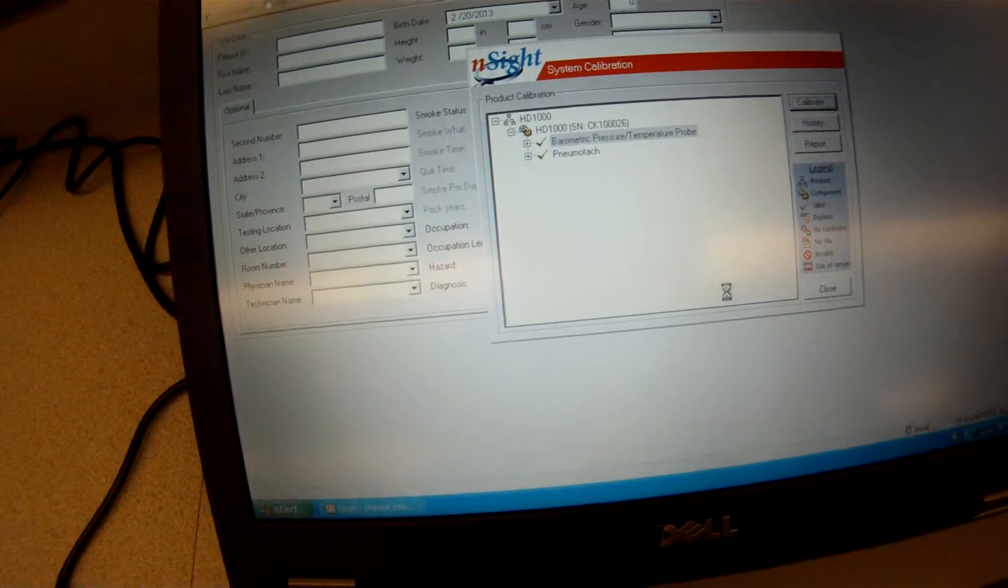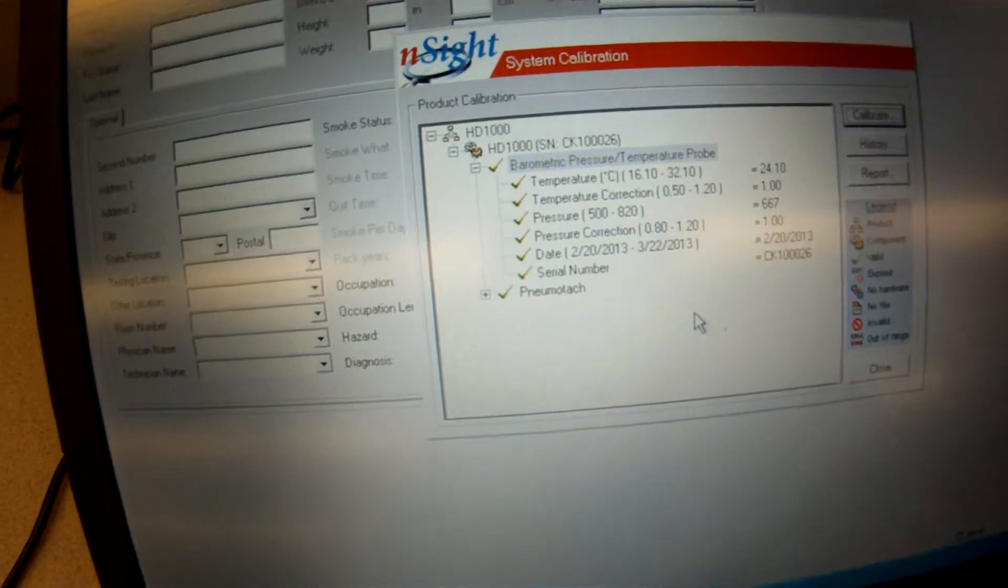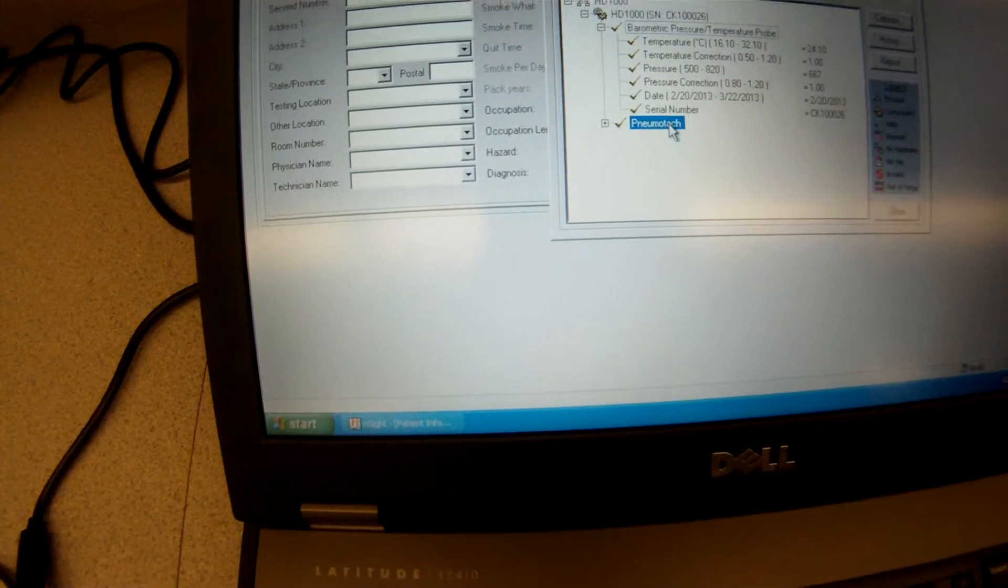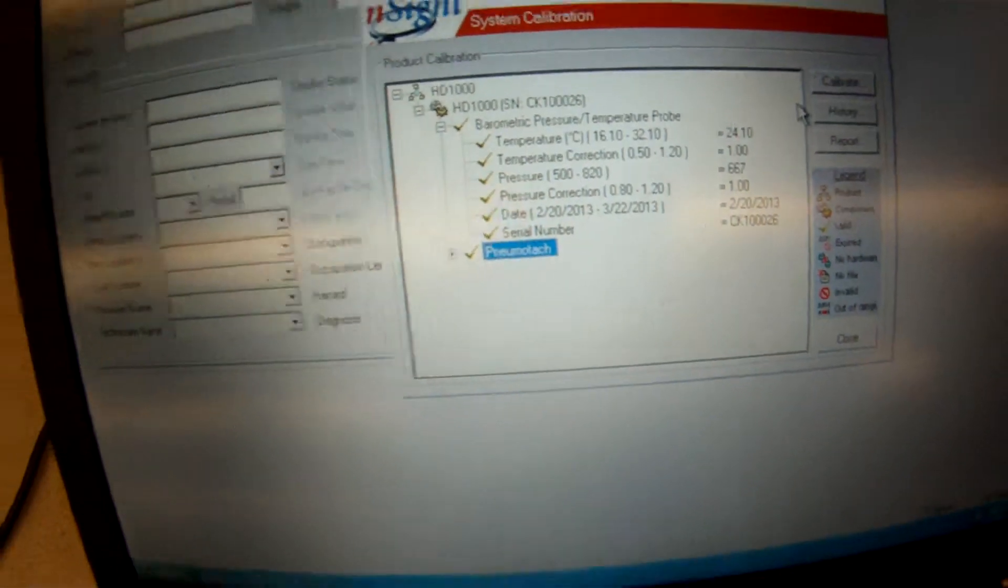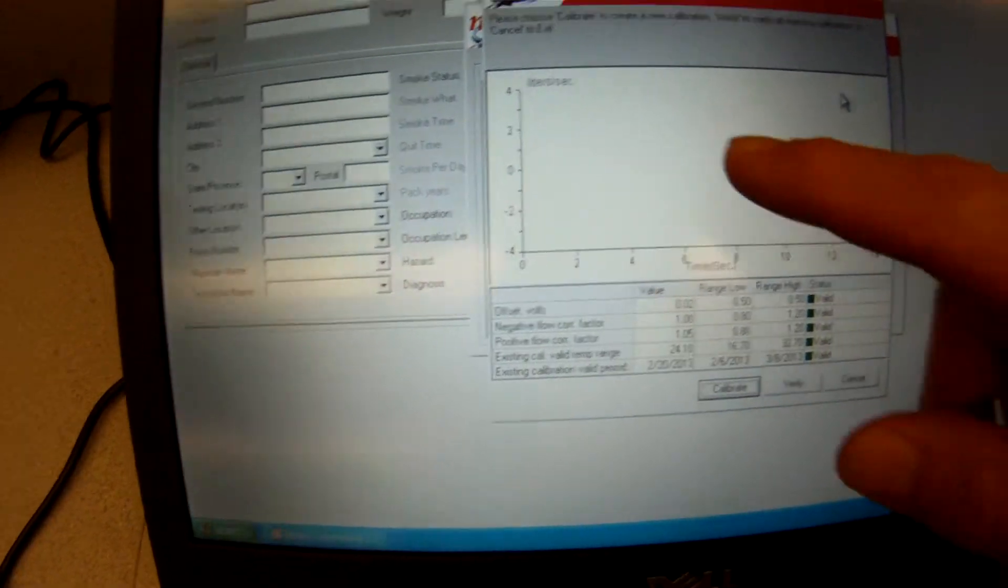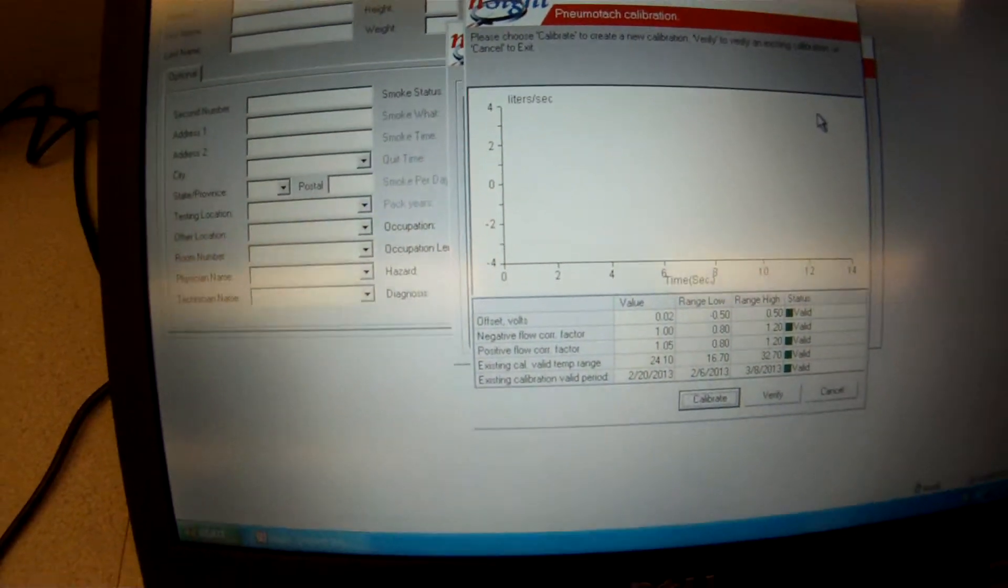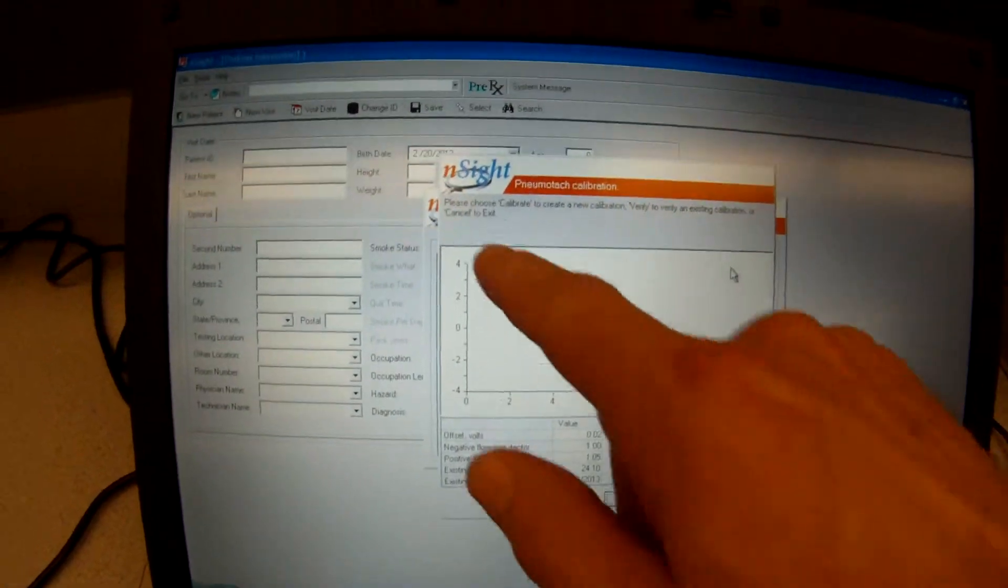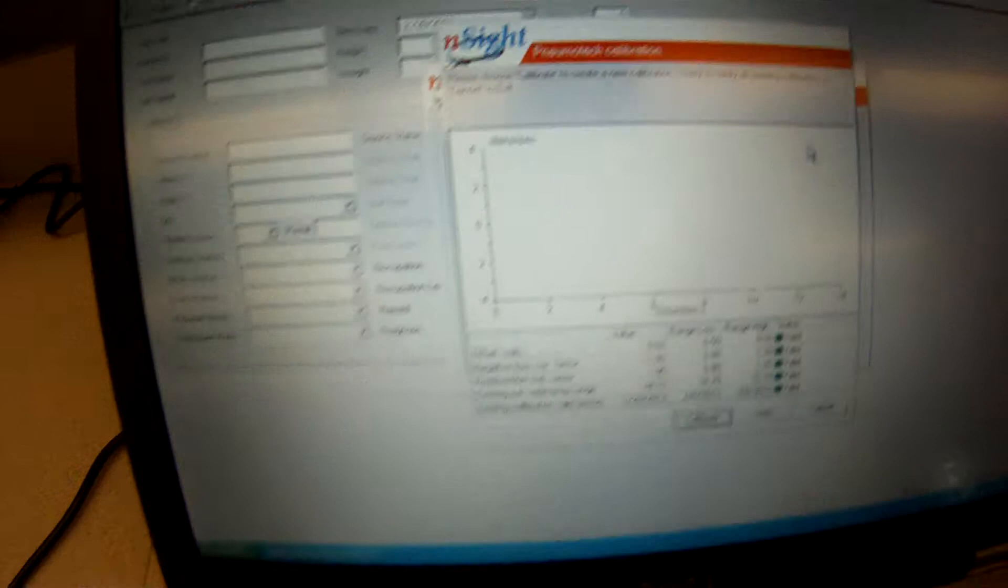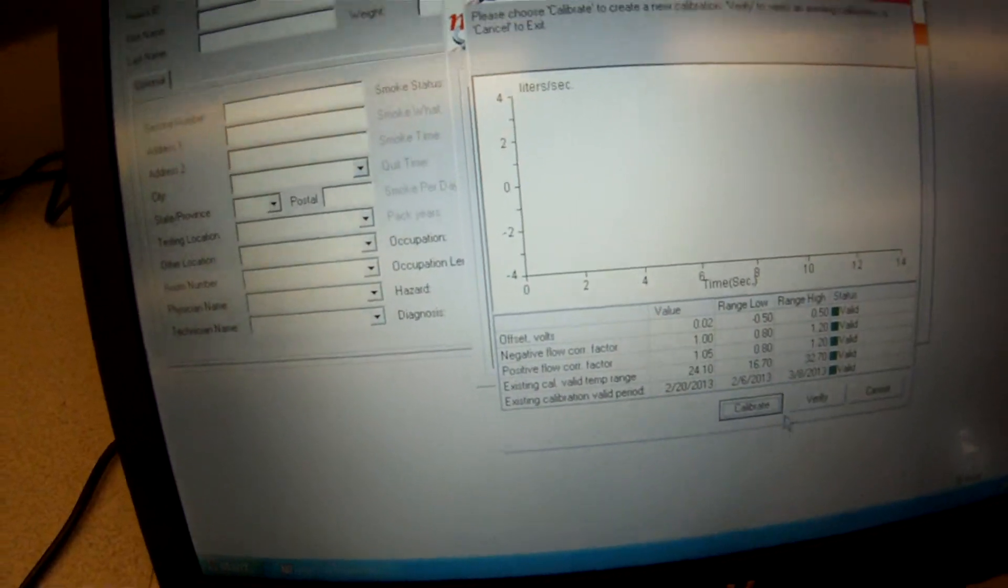Now we're going to actually calibrate the pneumotac. So to do that, we just click on here and we go up to the calibrate button. Click on that. It gives us a little screen telling us what to do. Follow the instructions carefully. Choose calibrate. So we're going to go down here, click on calibrate.